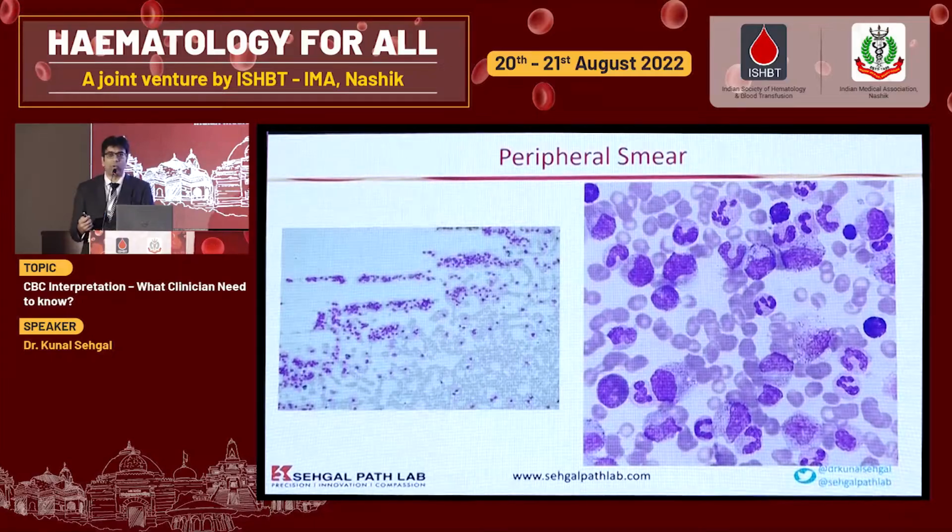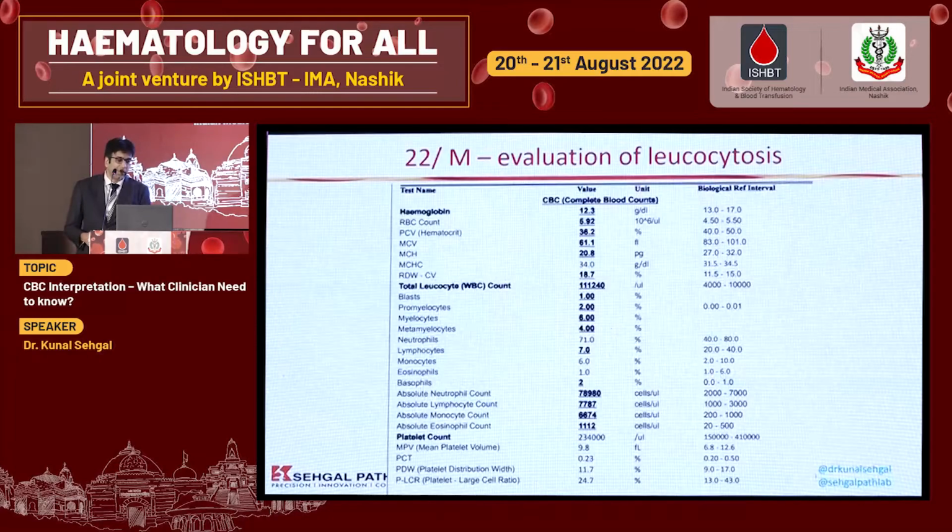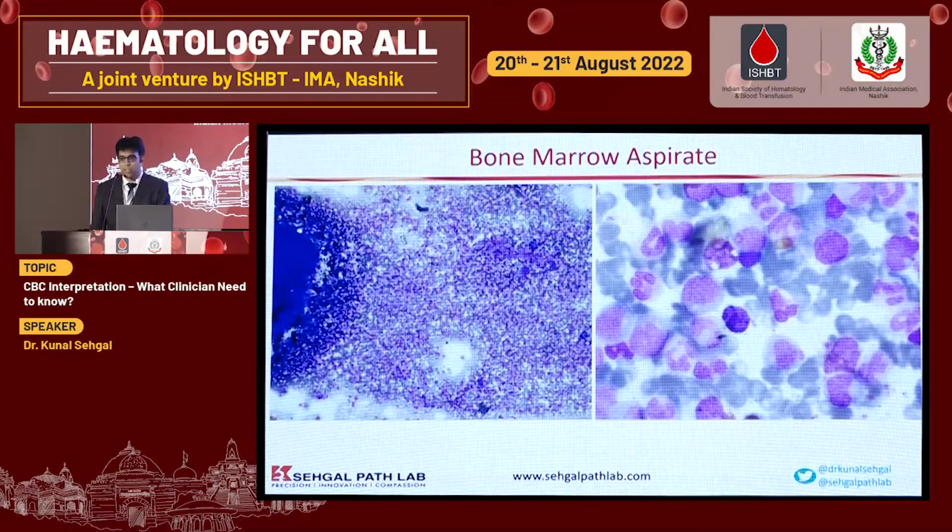I think one point, if I give you, there is a history of splenomegaly in this patient, though the age is young, and in India we do see this, we are already suspecting, is this a chronic myeloid leukemia. So this was the CBC, the next day the CBC came to us, again very similar, hemoglobin of 12.3, WBC count had already increased in the last 2 days to 1 lakh now. There is a left shift, there is occasional blast, there is basophilia, occasional NRBCs, platelets are adequate.